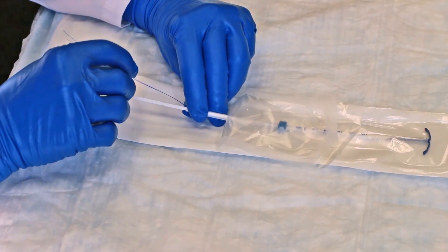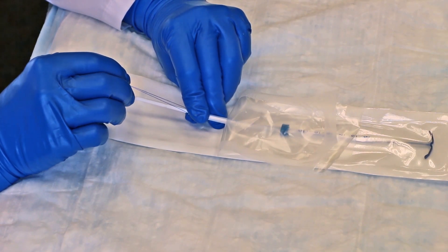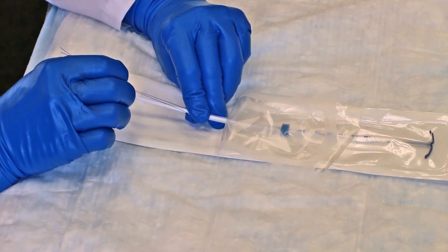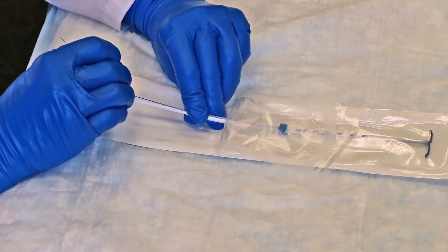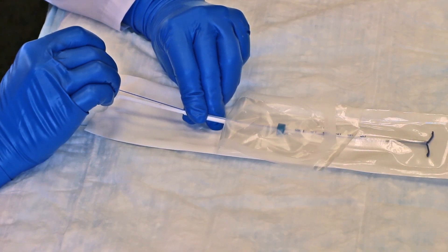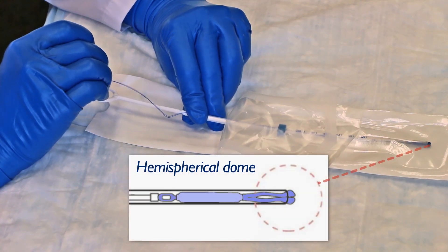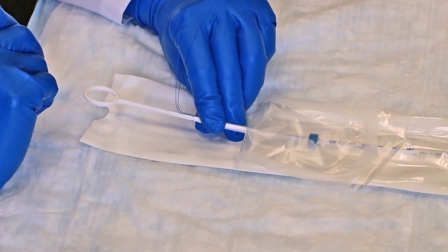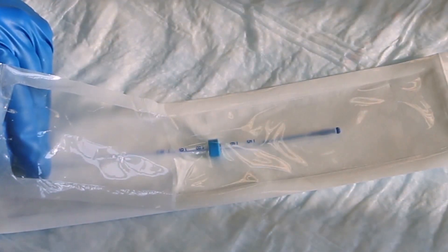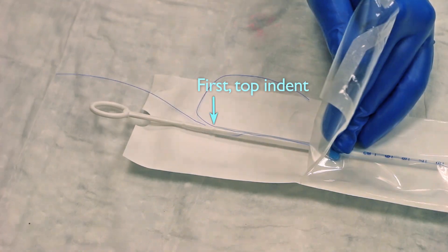Hold the inserter tube and rod firmly between the thumb and index finger. With the other hand, grasp the threads and pull the IUD down slowly into the insertion tube until the knobs of the lateral arms cover the distal opening of the tube, forming a hemispherical dome at the top. Keep a firm hold on the tube and rod to maintain position. The top of the rod should be touching the bottom of the IUD and the bottom of the tube should align with the first indent of the rod.